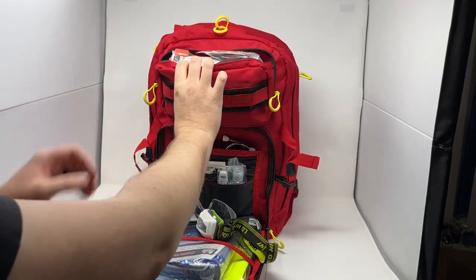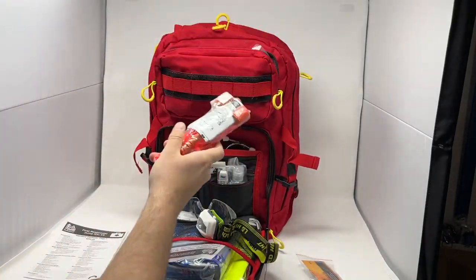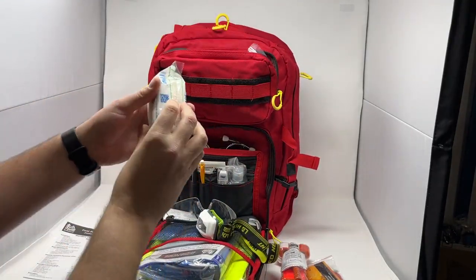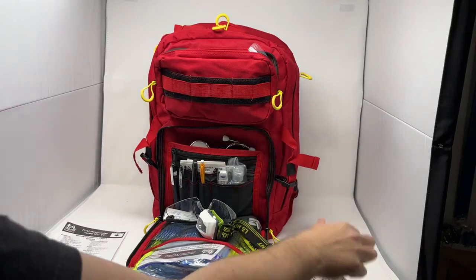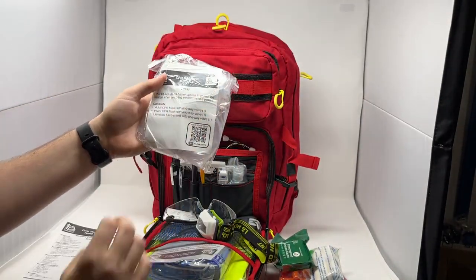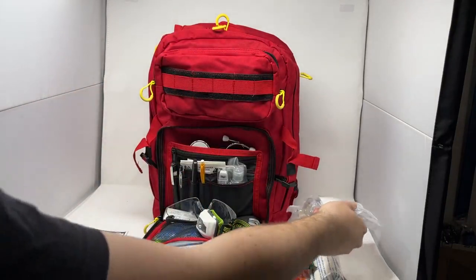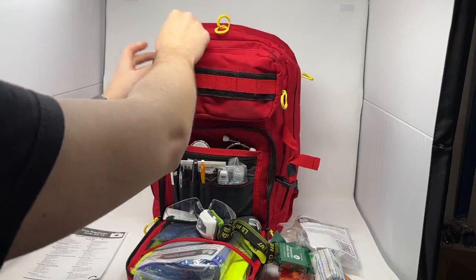Up top here is our emergency pouch. We have our window punch and seatbelt cutter for car access. This comes standard with the CAT Gen 7 tourniquet, although you can change this out for the SAM XT or the SOF tourniquet. We have our compact pressure dressing — a three-inch elastic wrap with a gauze pad attached for quickly controlling bleeding. We have compressed crinkle gauze for packing wounds, our CPR barrier module with a full adult-sized pocket mask, an infant-sized pocket mask, and a face shield with one-way valve. And then we have a pair of trauma shears to access patient injuries.